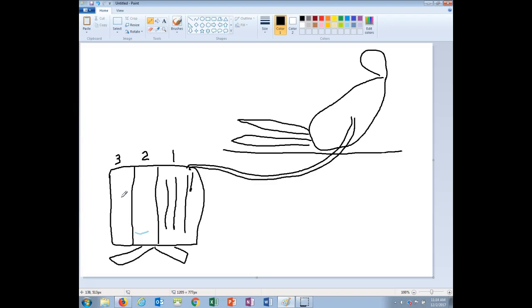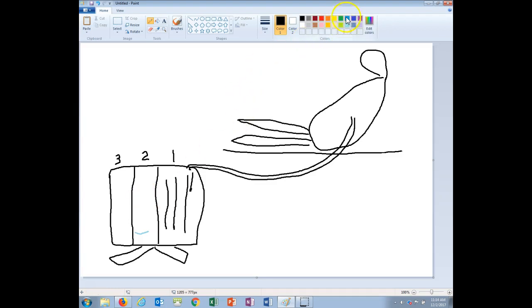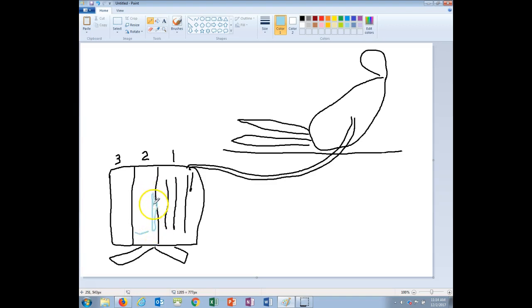Tidling, like I said, in our second chamber is going to be our water seal chamber. You're going to see tidling and that's absolutely fine. Tidling will happen when a person breathes during respiration. So what you're going to see here going up and down is going to be tidling.